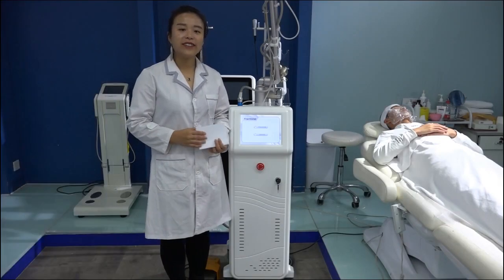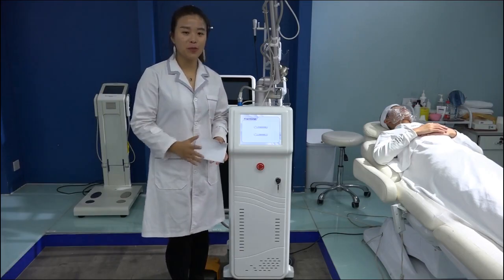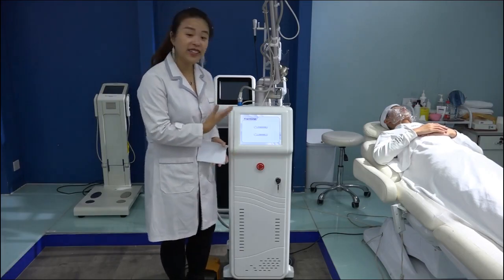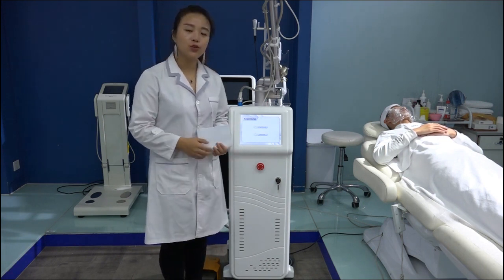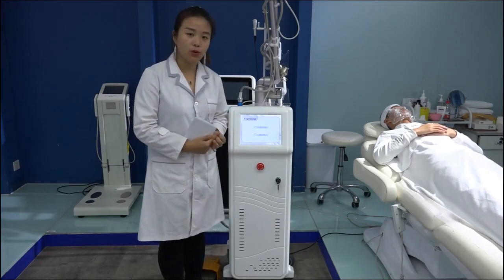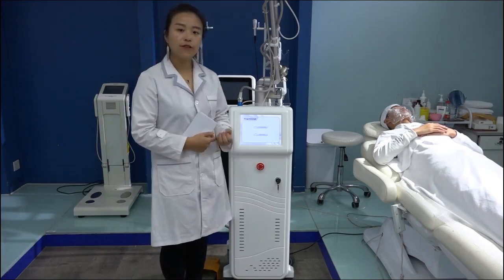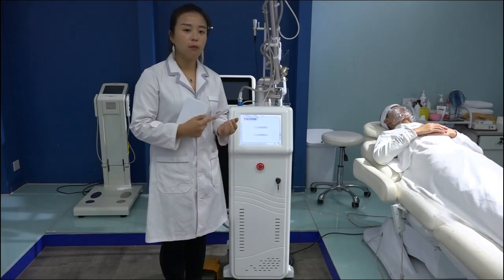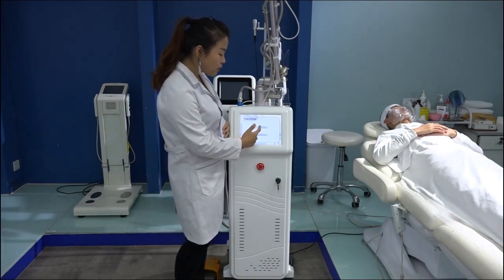Okay, now let us introduce how to set the parameters for different treatment scopes. I will give you suggested parameters for the interface setting. You can see there are 2 modes optional. Fractional mode, if you do scar removal, acne scar removal, stretch mark removal, skin rejuvenation, you can use fractional mode. If you want to use the cutting head to do skin tag cutting or mole cutting, you can use normal cutting mode. Let us introduce fractional mode first.